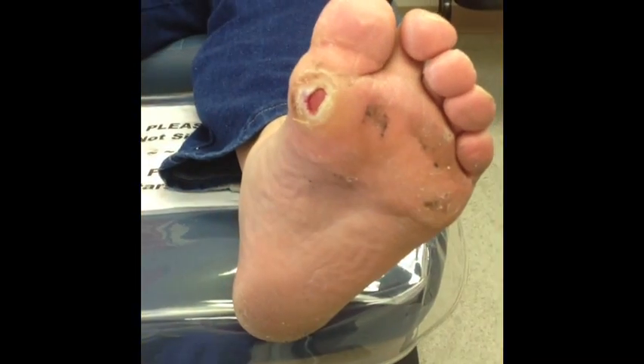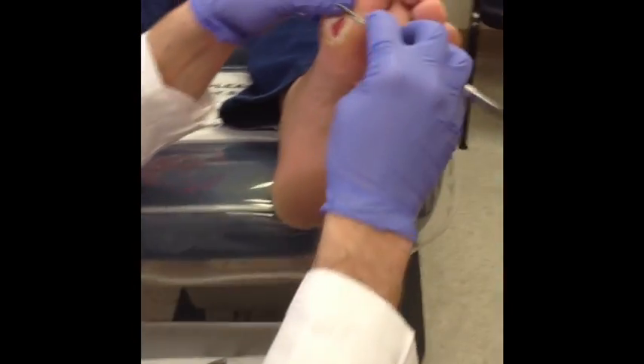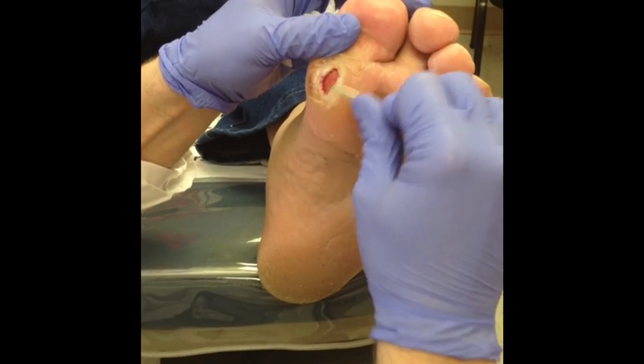So you do the first pass with that, and then I'm going to grab a 15 razor blade here and get it down to about the same height as the skin around the area.